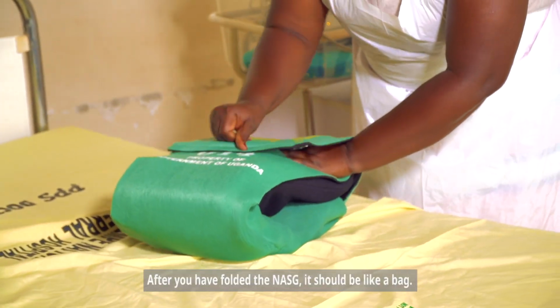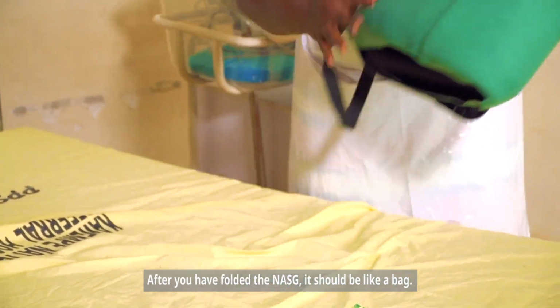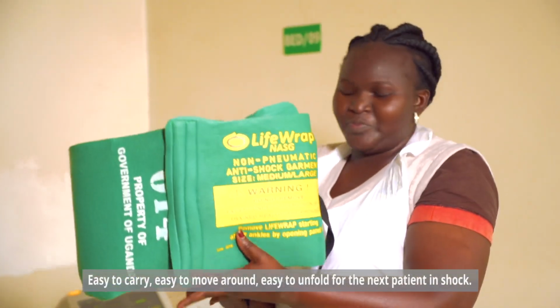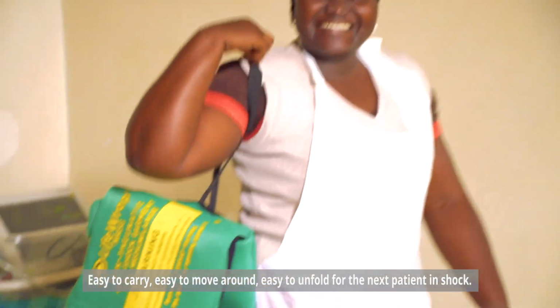After you have folded the NASG, it should be like a bag. Easy to carry, easy to move around, easy to unfold for the next patient in shock.